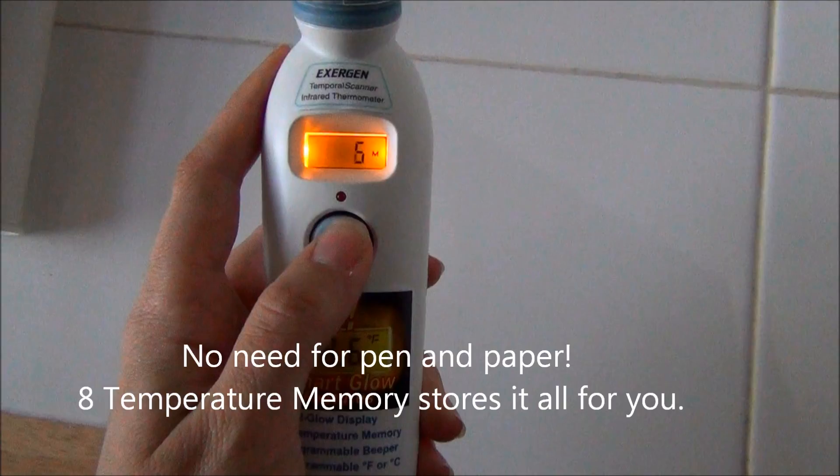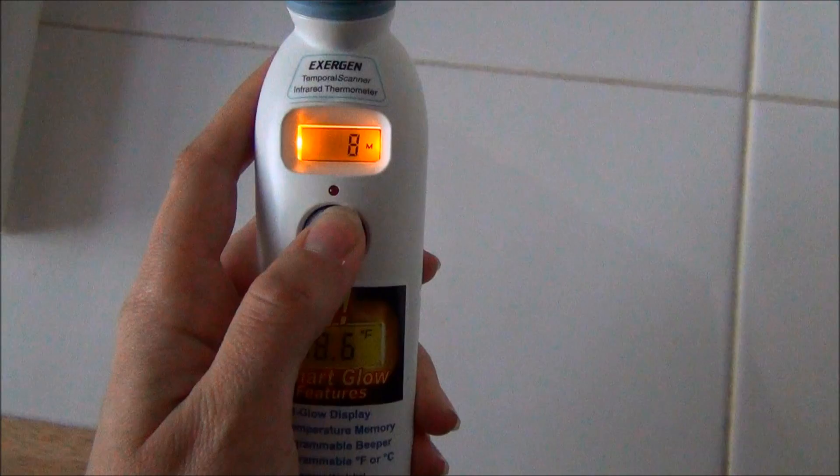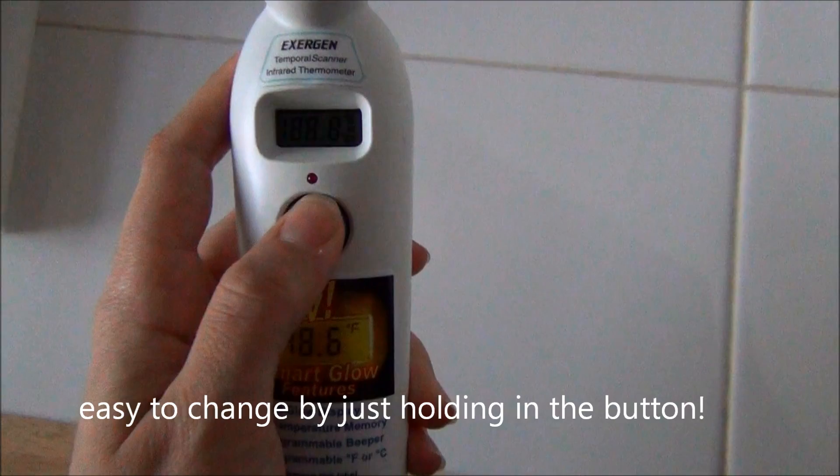My favorite feature is the shh to loud setting. When you want to change the feature all you have to do is hold it — I'm going to put it back on Fahrenheit. Now I'm going to turn the sound back off: you go to loud, then press for shh.